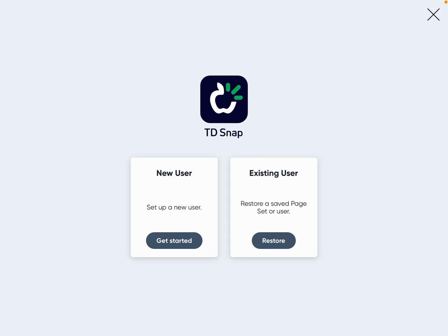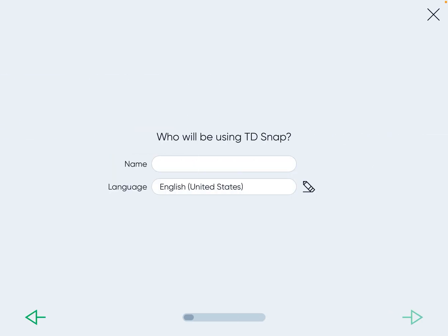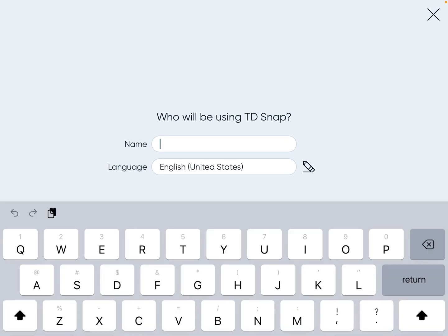With NTD Snapcore, you have the ability to have bilingual versions, and this is how you would set that up. Press on the app when you are ready to set something up. Go to New User, Getting Started, and name it.